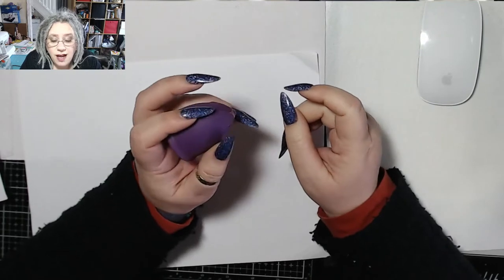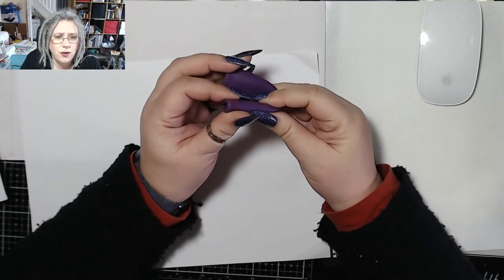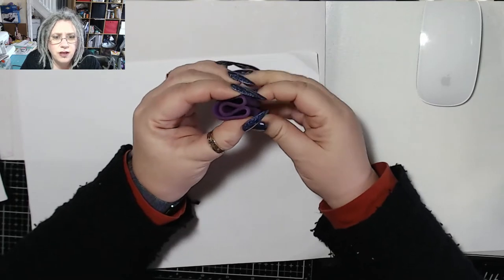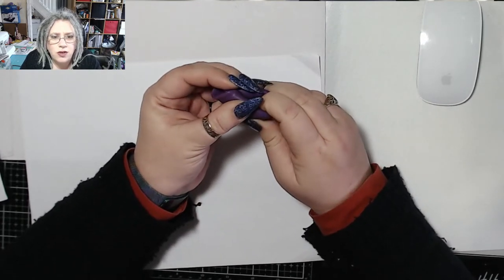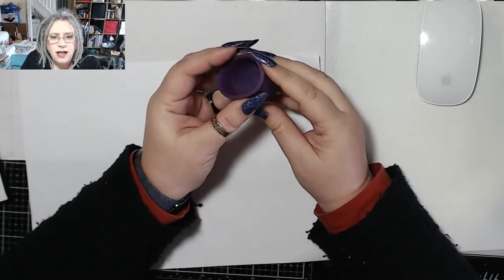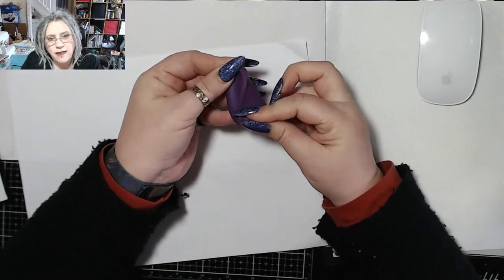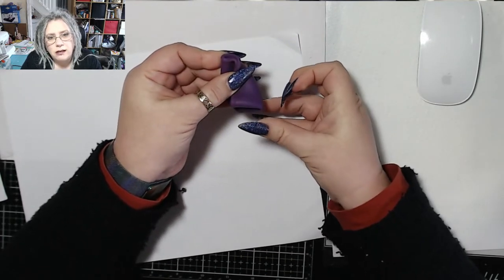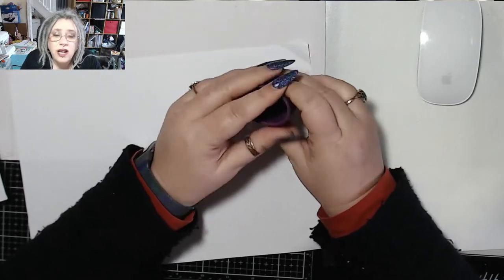First off, insertion of the cup. There are loads of different folds. There is the C fold, which is that one. There's the punch down fold, which kind of goes like that, but I personally can never get it to work. There's the seven fold, which goes down like that — that's another good one. There's loads. I use the C fold.